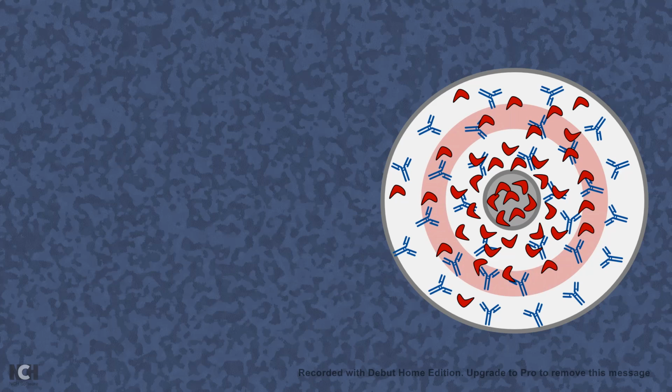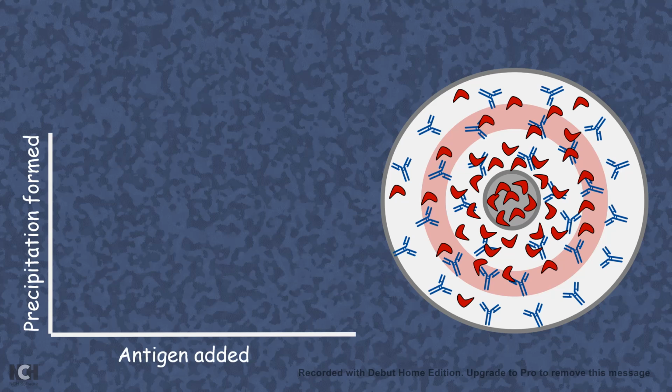Before that, let me tell you that in the situation where the antigen and antibody are in an equivalent ratio and equivalence is reached, then a precipitation band or precipitation radius forms like this. Now here we are going to talk about the antigen antibody amount and how the precipitation would look, or what type of interaction would be there.